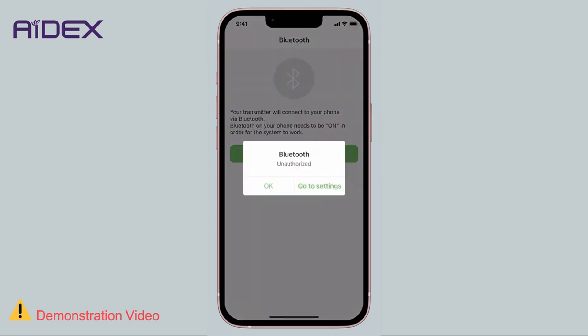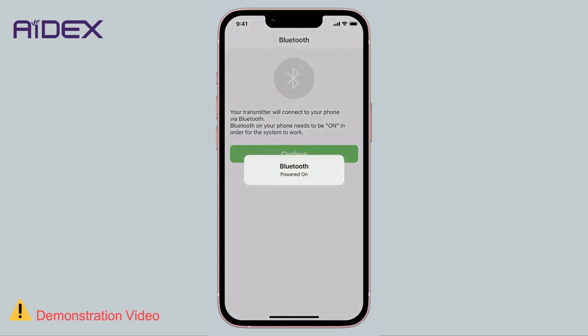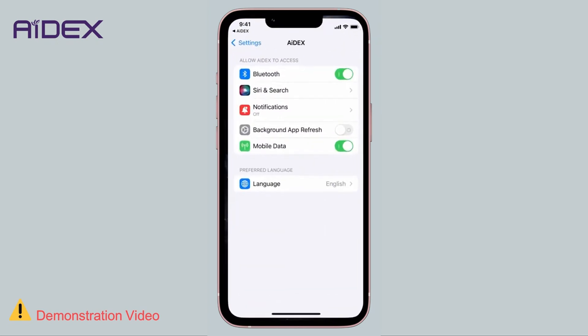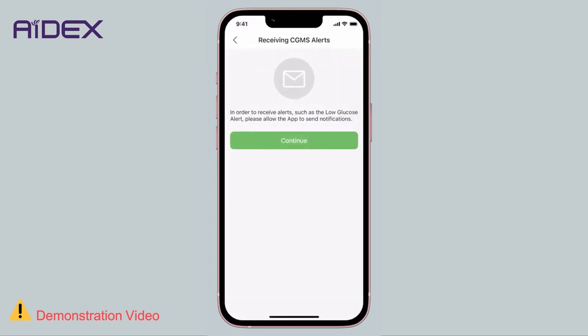The app will request permission to use Bluetooth. If it is not already enabled, you will need to activate it from your mobile settings. Since the application heavily relies on Bluetooth functionality, tap Continue. The app will also ask for permission to send notifications — choose Allow, in order to receive alerts for high or low blood sugar levels based on predefined settings.